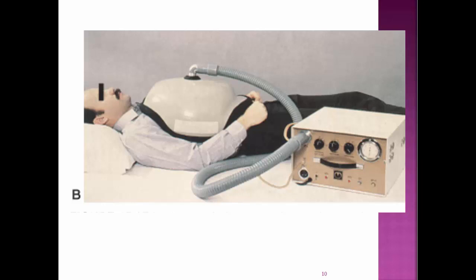In fact, when it's time for inhalation, you can't talk. It makes you inhale. Now, this shell is rigid, and it has to be rigid so that it doesn't collapse down and it causes the chest to rise. So you always have to have something rigid there. The same idea: the higher the pressure, the bigger the volume that's delivered. The rate is determined by how many pressure gradients are caused in one minute.